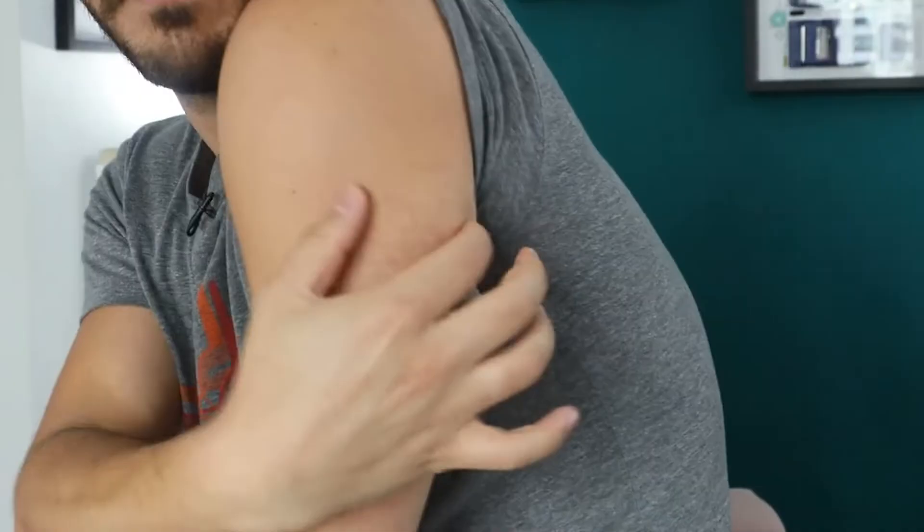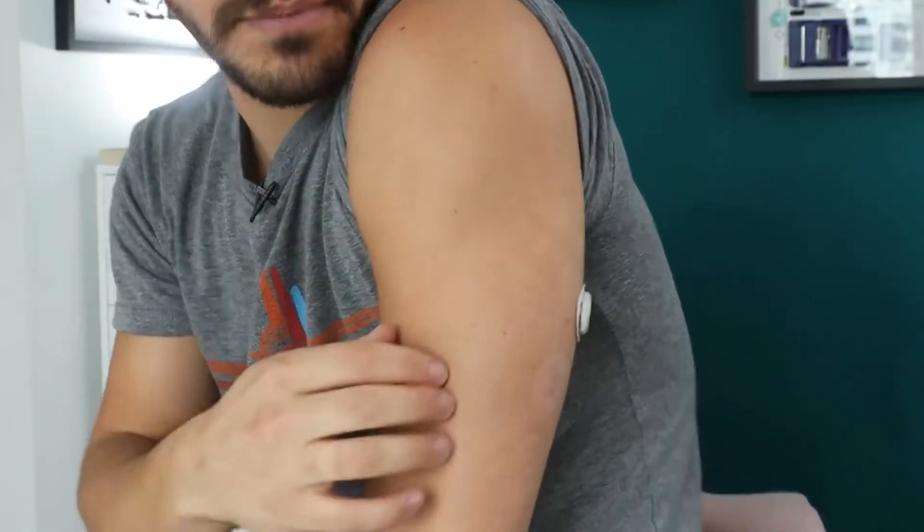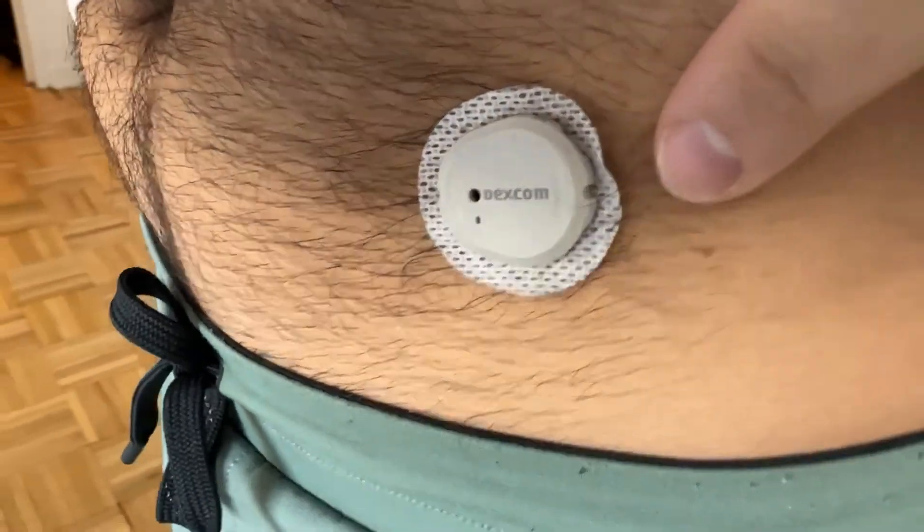Let me start with the build of the Dexcom G7 — how it feels. It is so small. It's under my shirt right now — you can kind of see it. It is so freaking small. I forget that it's there. I sometimes even forget where on my body it is. I have to search for it — no joke.